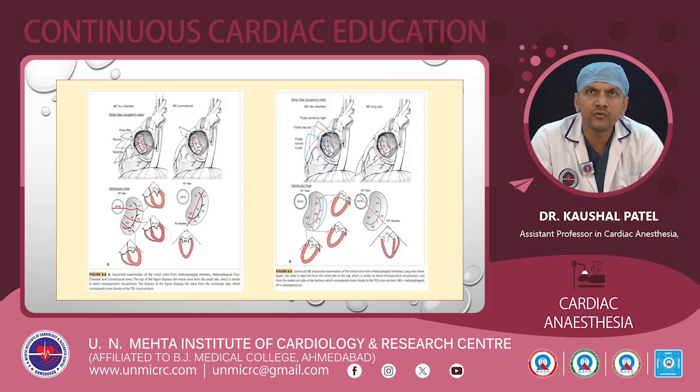This is the TEE view, how we can evaluate the mitral valve in TEE. The mitral valve is saddle-shaped, so it is not in the same plane. The annulus is in one plane, and the coaptation point of the anterior and posterior mitral valve leaflets is below the annulus plane. So in TEE, the evaluation of the mitral valve is segmental.